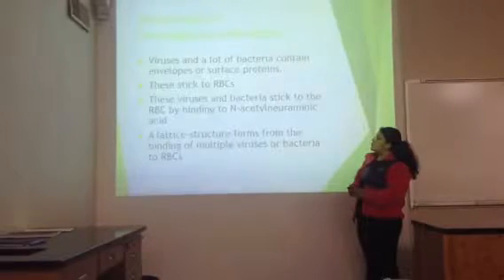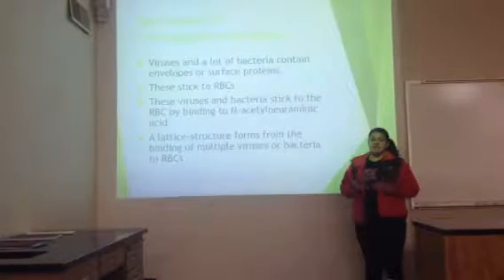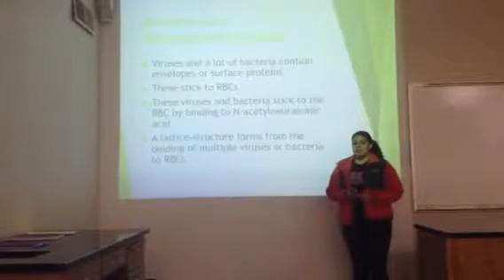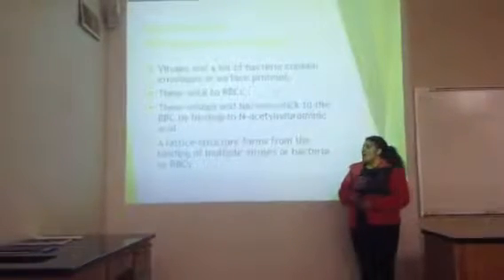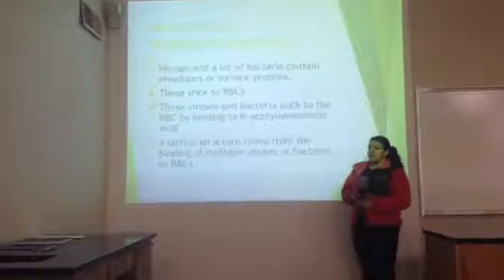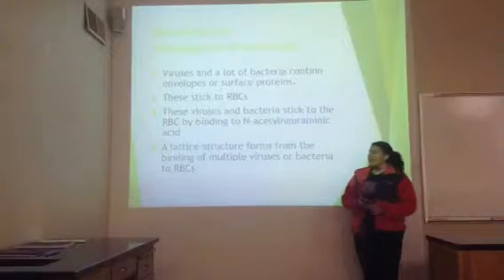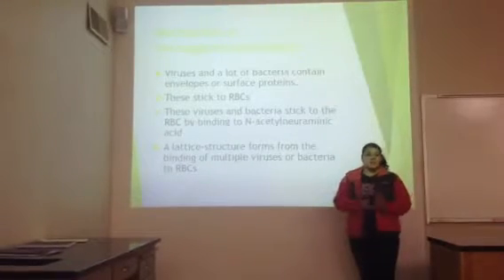The viruses and a lot of bacteria contain surface proteins and envelopes. And this is what actually sticks to the RBCs. These viruses and bacteria bind to the N-acetylneuraminic acid. And like I said, that's what causes the binding.